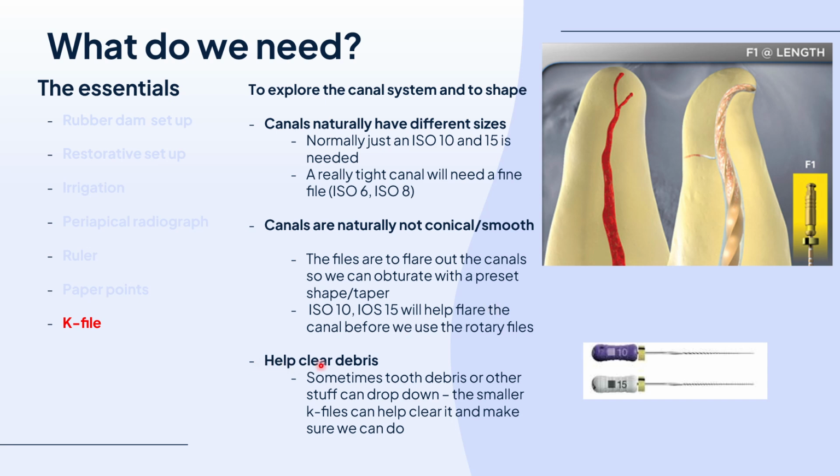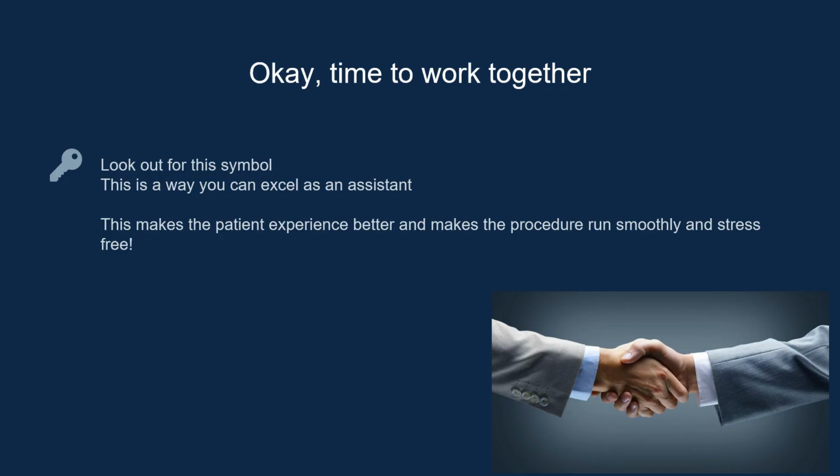Yeah, cool. So they help clear debris. Sometimes tooth debris or other stuff can drop down. The smaller K-file will help clear it. Anyways, so we use this, as I said, sometimes when you open to get any debris out.